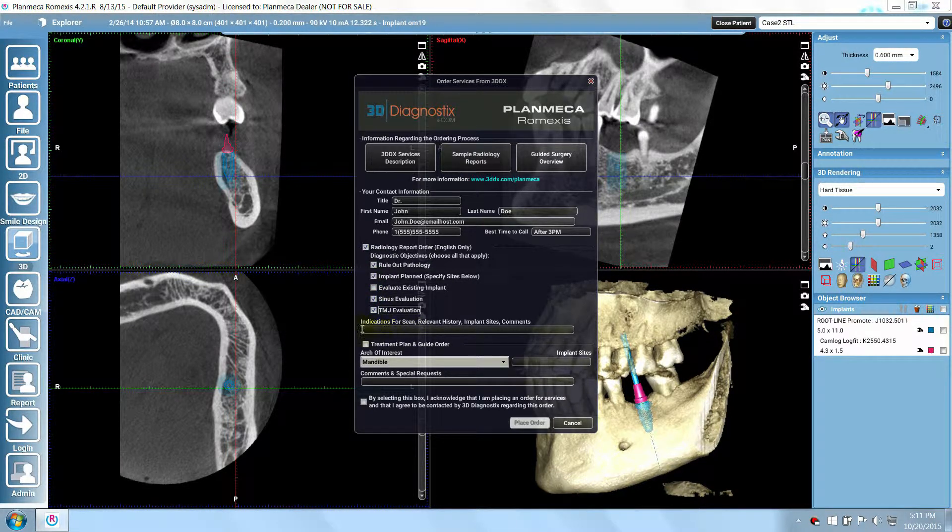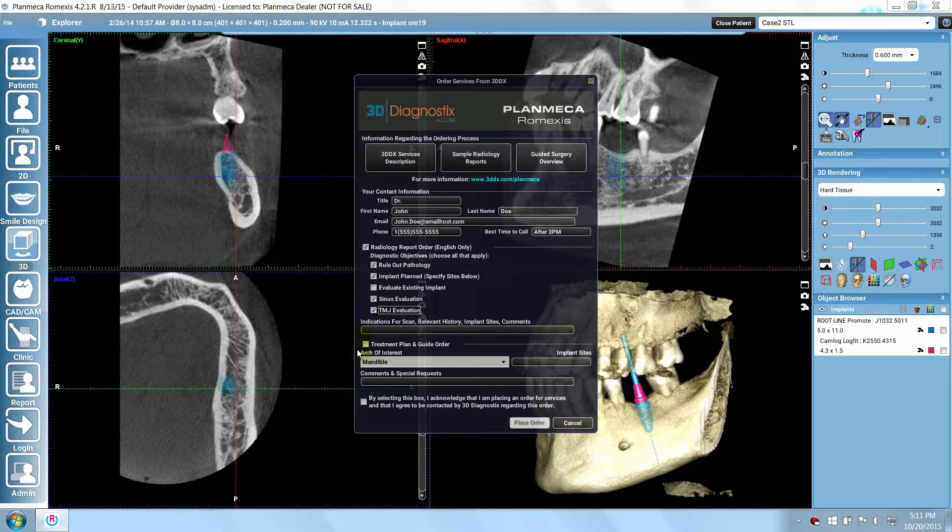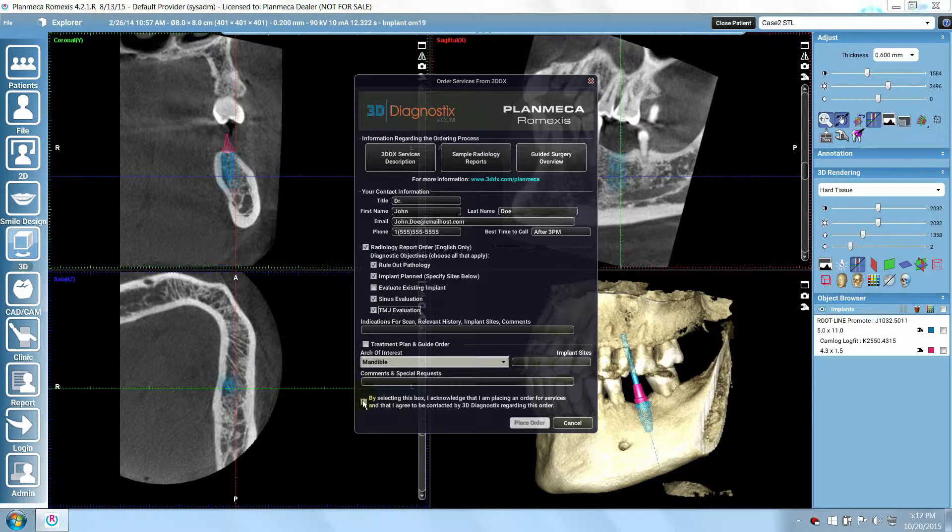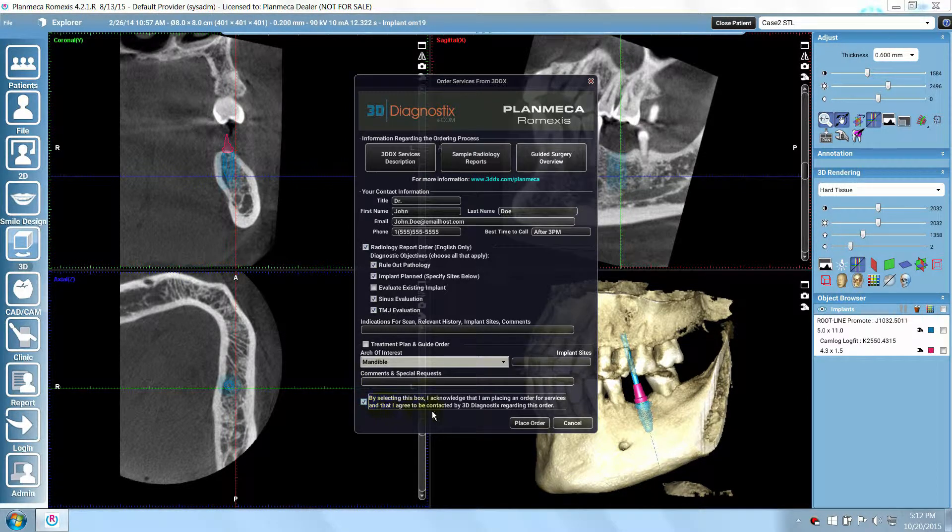If necessary, you may enter comments or additional information. After all the information is complete, click the Place Order button.